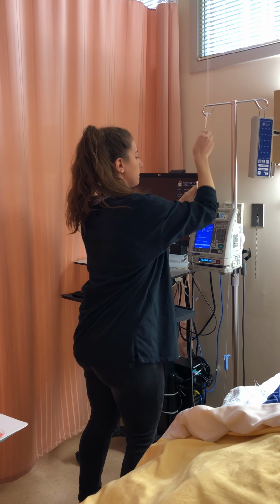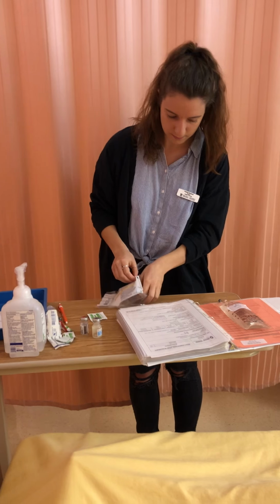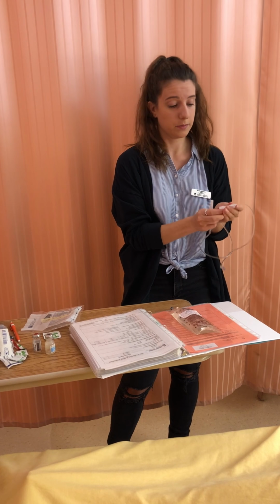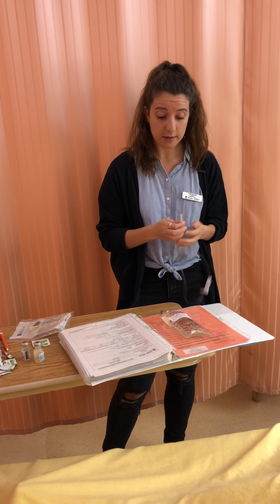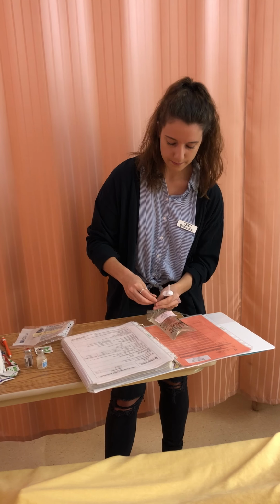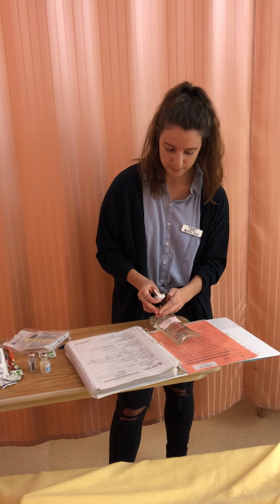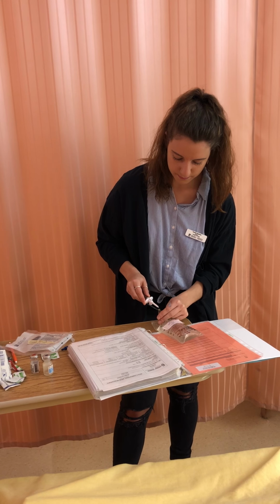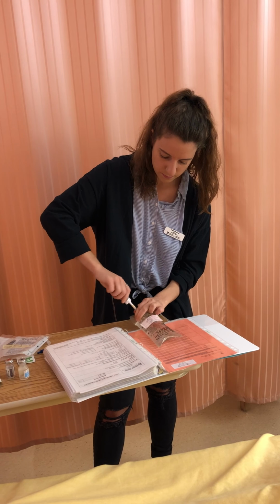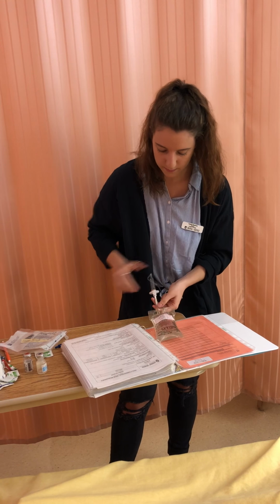And just to ensure that the plunger is being depressed, I'm using sterile technique. I'm going to lock this off, and using sterile technique, I'm going to puncture my bag. And I will continue to monitor for improvement of the patient's symptoms, looking at the lab values and vital signs. I would do vital signs before I give this medication as well as after this medication.